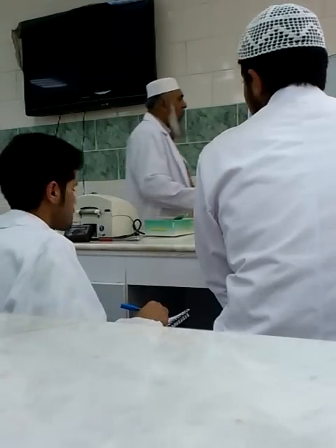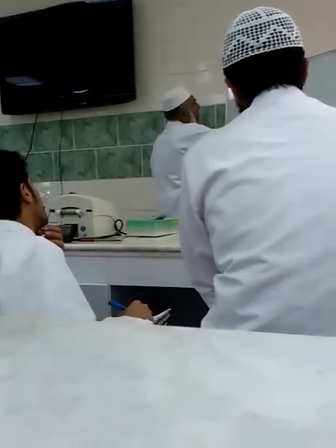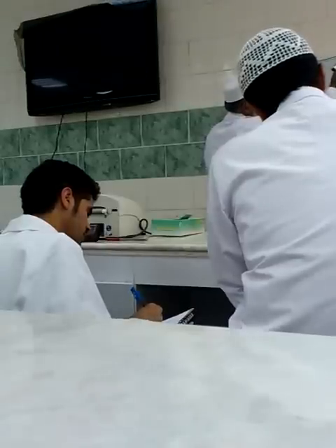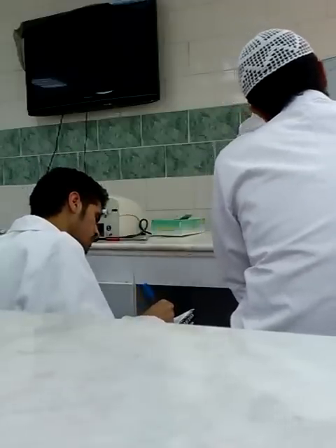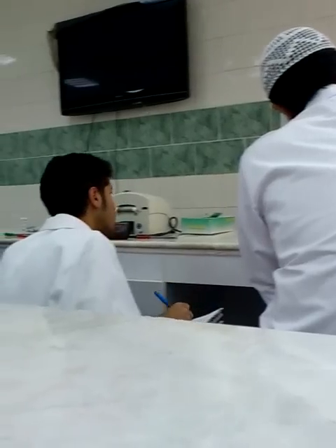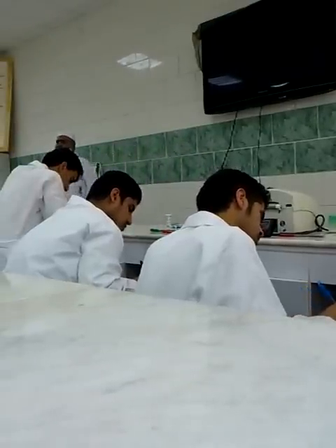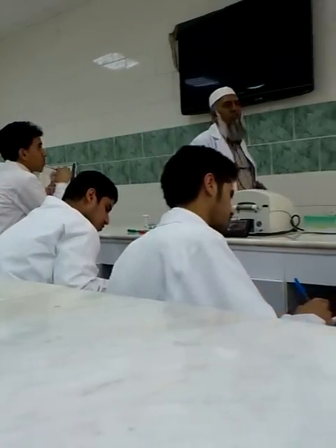We will go through the effect of exercise on blood glucose level. So, effect of exercise on blood glucose level in a human subject is our today's topic.